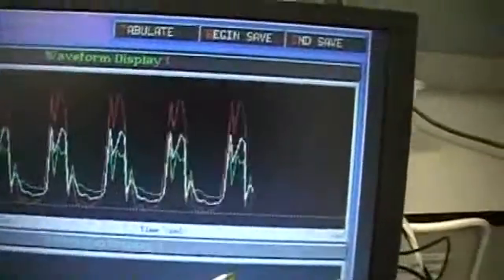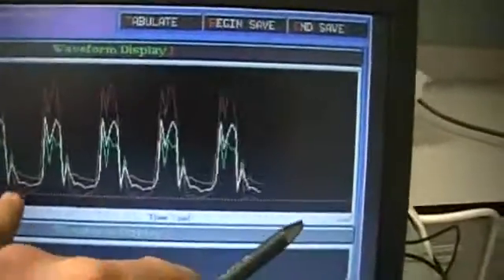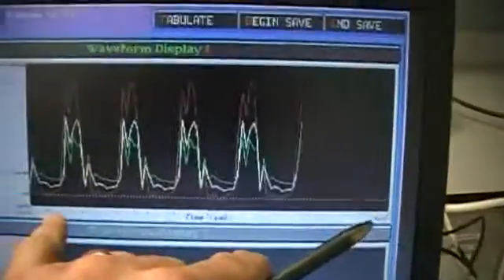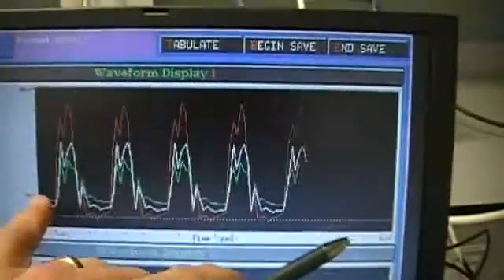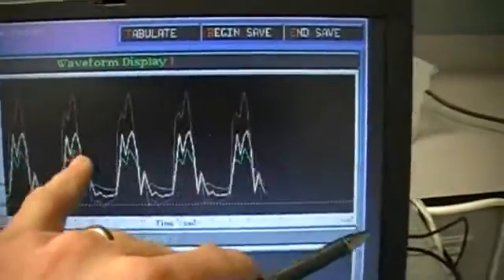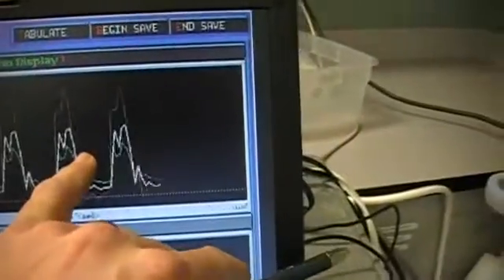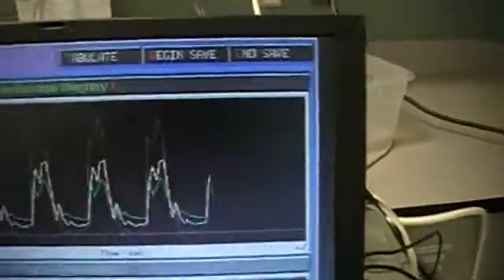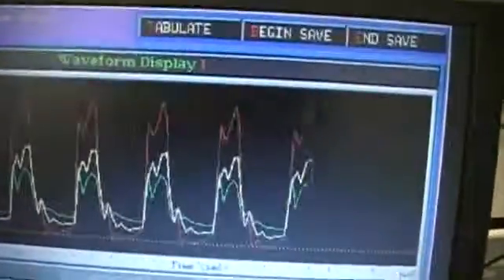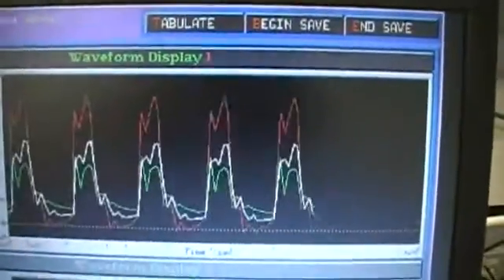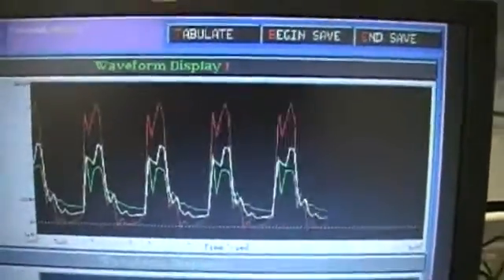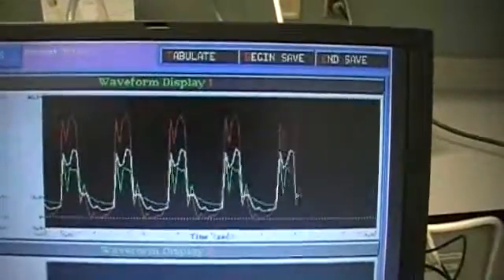This is one second of time. You can count one, two, three, four, five, six — six breaths per second, just as we'd expect.